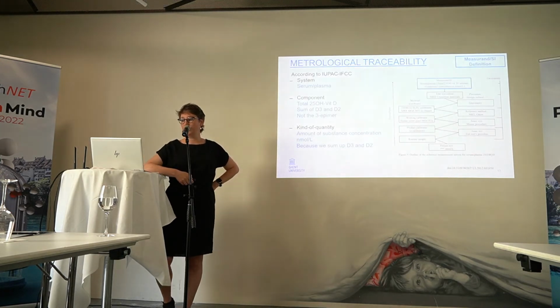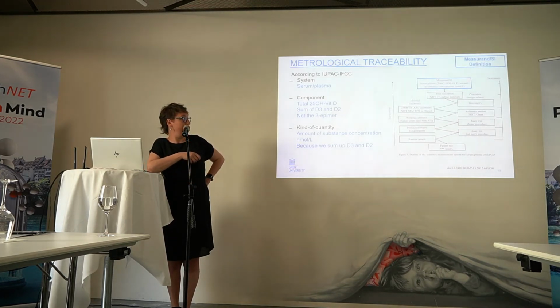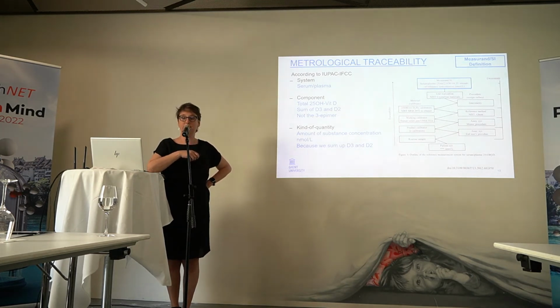So for 25-hydroxyvitamin D, we have first defined what we want to measure. And that is important in everything we do as analytical scientists. Up front, you define what you want to measure. And then you define what you will be using it for, and hence, what the needs are for your method. Based on that, you will derive quality specifications, which means a maximum CV, a maximum bias, and then you start validating and try to meet the criteria you have defined up front.